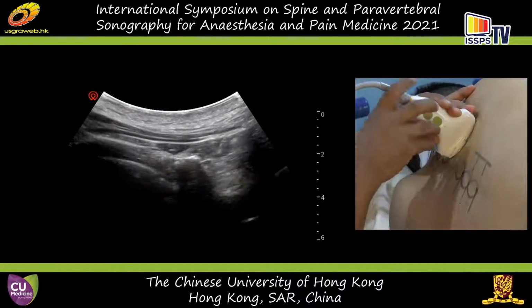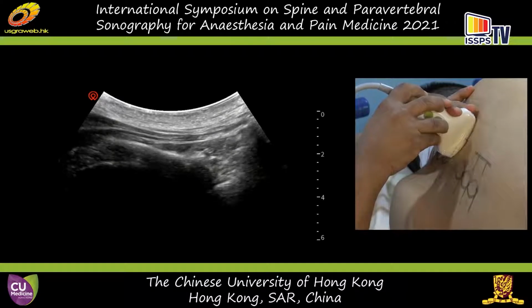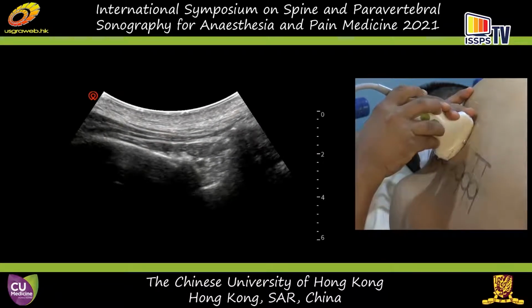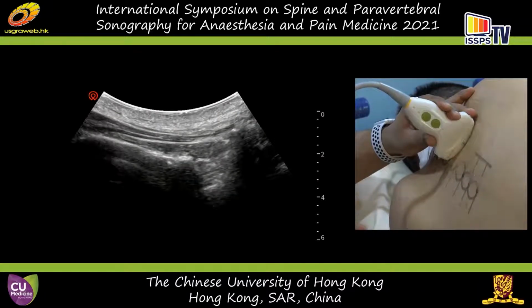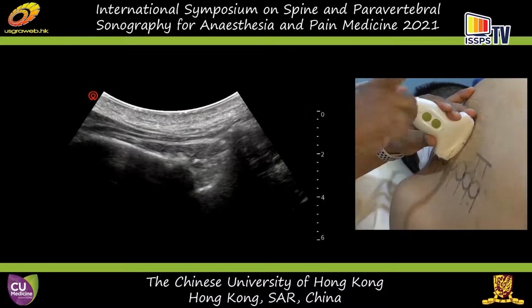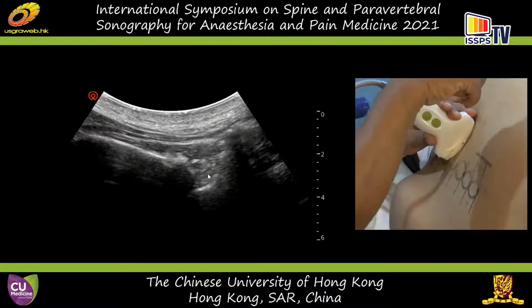Now, in this case, you can see here, we are seeing the first window. Now, in this case, you can see the tip of the spinous process. Can you help me, Ranjit? You can leave the camera. Just can you put the pointer for me, please? Yeah, Ranjit, you just use this trackball. Yeah, you use the trackball.